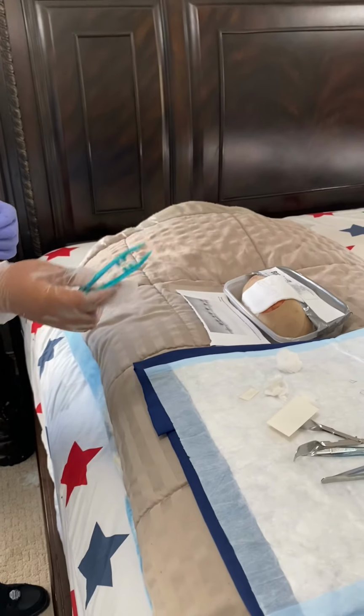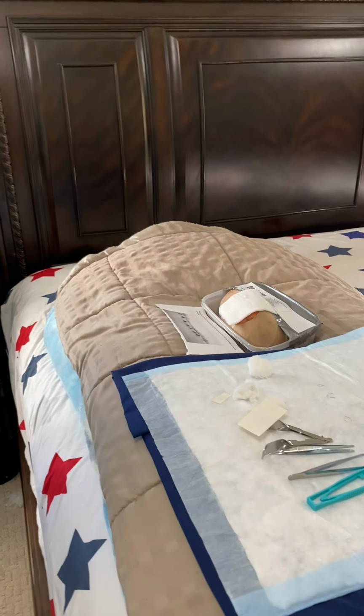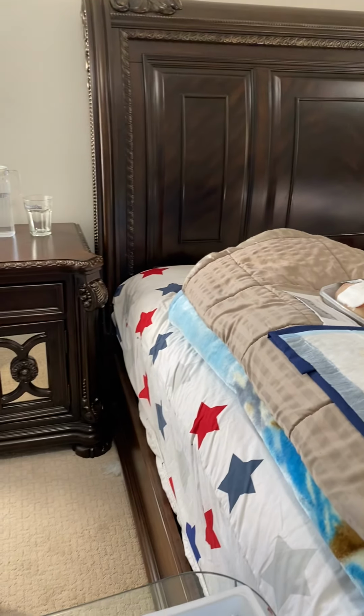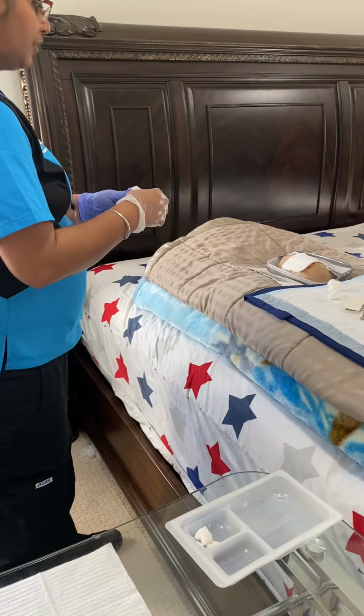I don't need any more, so now I put the forceps on the side. Now the next step is taping. I take the tape from the table and I have to tape on 4 sides.